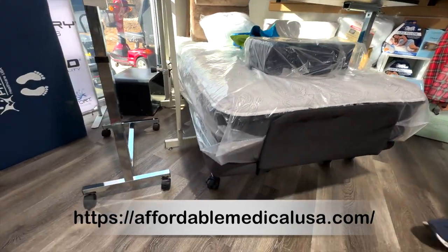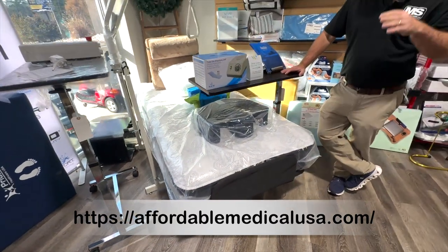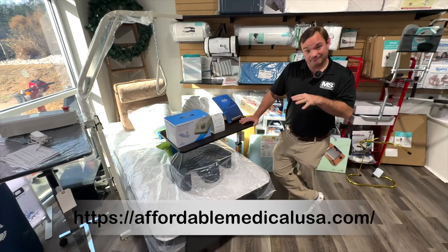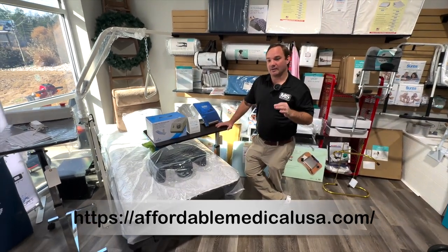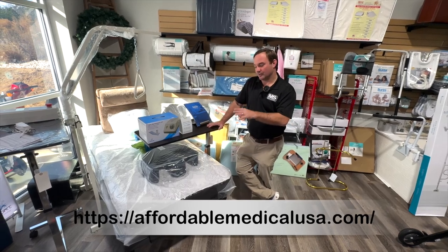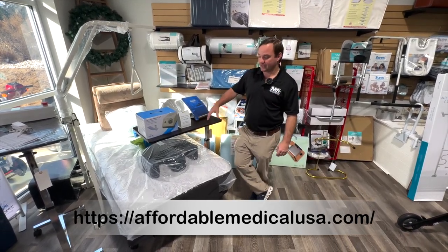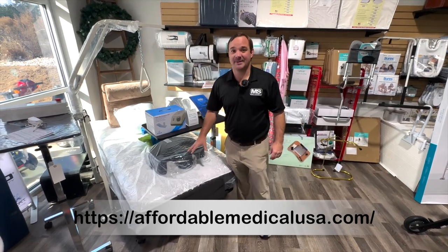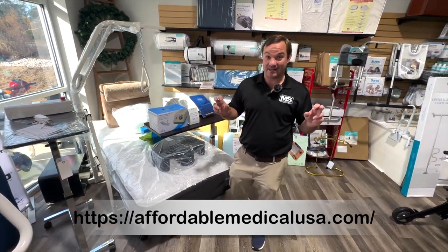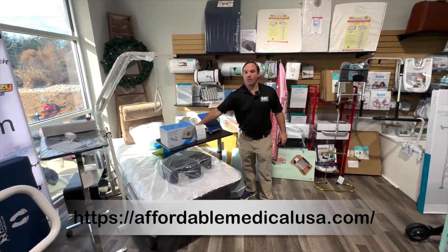Flexi Bed — we do a lot of these. We have a good video about this bed and we get a lot of compliments about that video. If you want more information about the Flexi Bed, check out our Flexi Bed video. This is a home-style bed just like a hospital bed, but they won't call it a hospital bed. The head and feet all work powered — and then it's a Flexi Bed high-low, so it comes up and down.